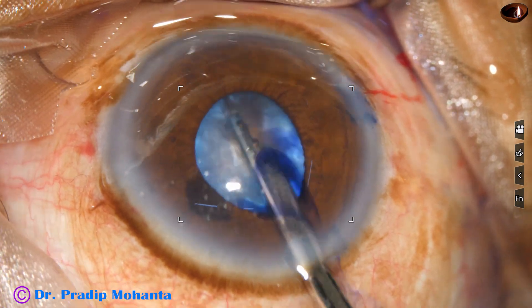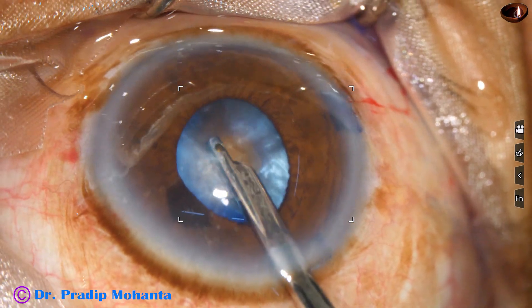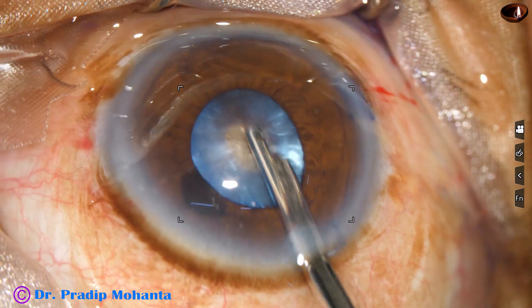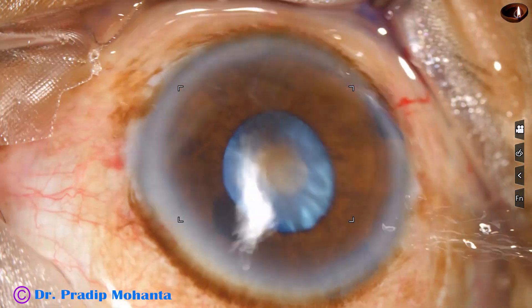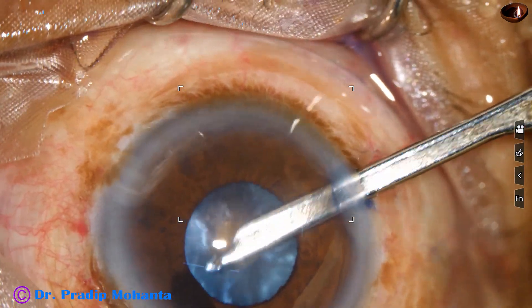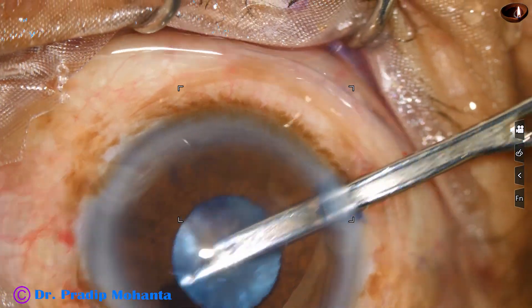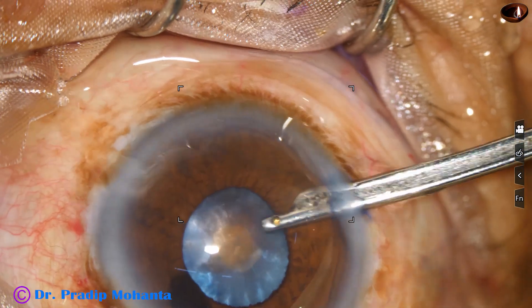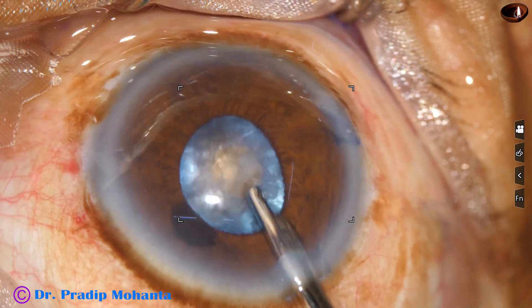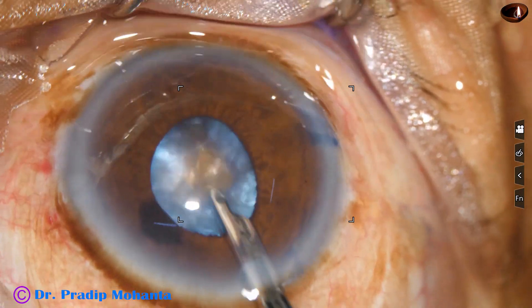Now I aspirate some cortex to make the chamber deep. The anterior chamber was very shallow because of the intumescence of the cataract. So I aspirate cortex. It took some time to aspirate a significant amount of cortex so that the anterior chamber becomes deep when I administer viscoelastic substance.